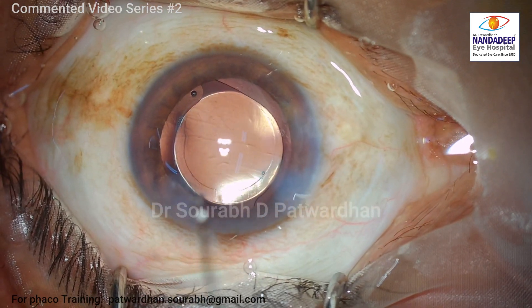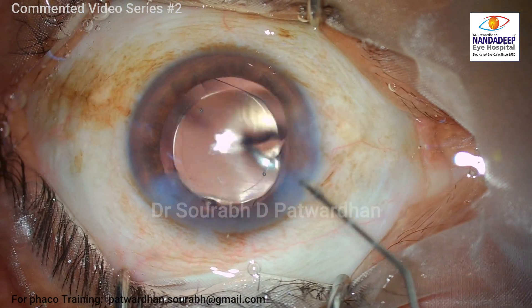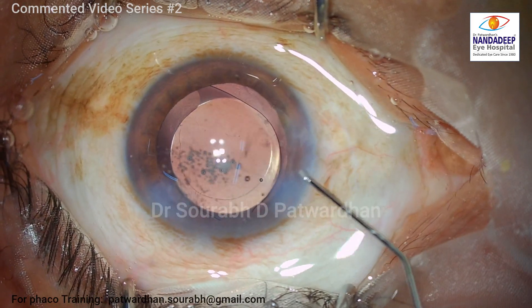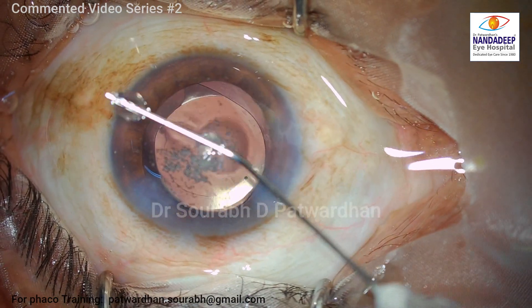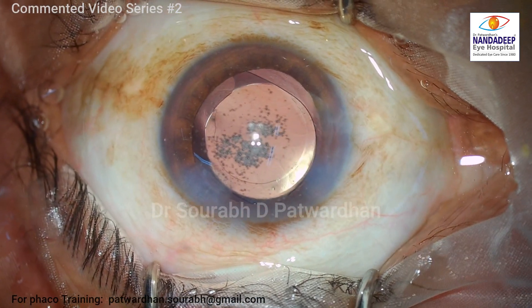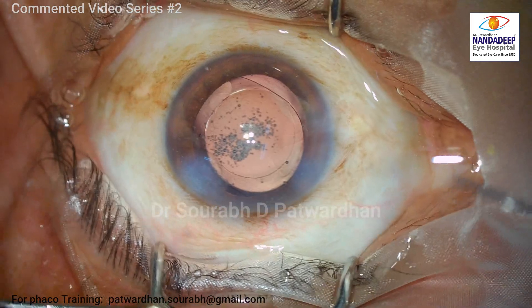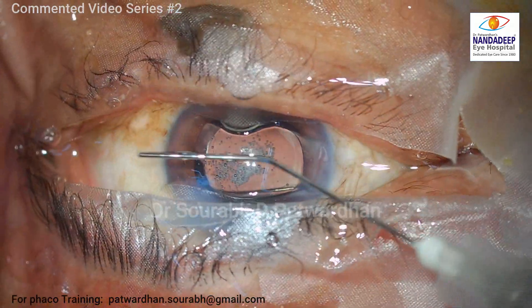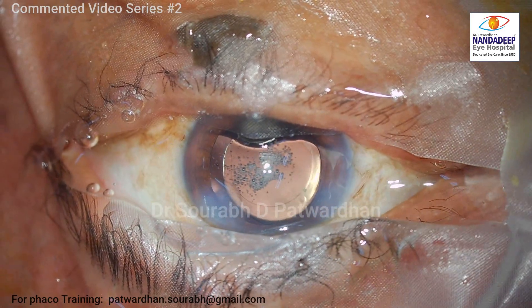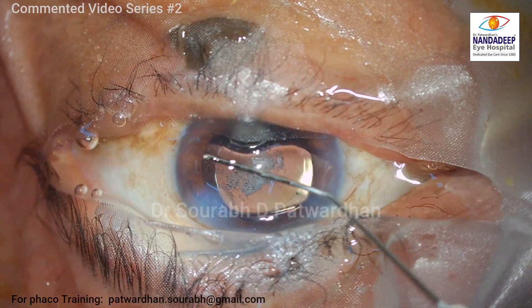There's the hydration of the incision from the side port and from the main incision. It is important that the AC is well formed at the end of surgery without much leakage. I ask the patient whether they can see the light before I finish, because it is important to have the right intraocular pressure at the end — not too high. I felt the eye was a little bit hypotonous, so I hydrated again, and after removing the speculum I checked the IOP. It was slightly less, so I injected some BSS and some Vigamox into the eye.